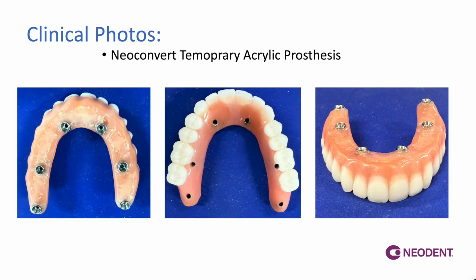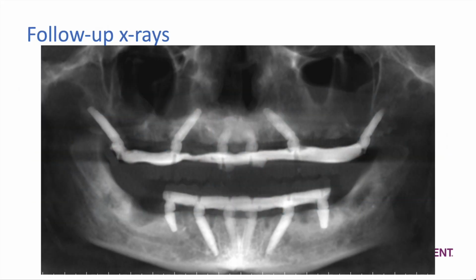And all of our contours are flat or convex. There are no concavities here, so it's highly cleansable, highly polished, and we have a great result. This is what these cases look like on x-ray. So we want to take a follow-up x-ray, one to confirm if any implants have failed, which is unlikely. The other is we want to confirm full seating of our Neoconvert copings. And here we can tell that everything is fully seated upon delivery.